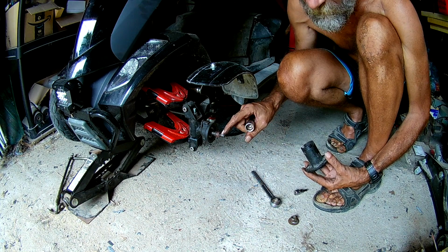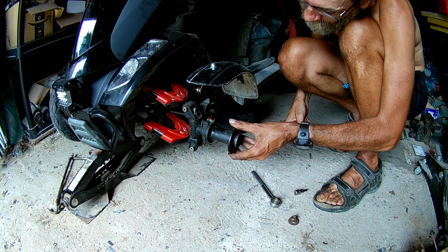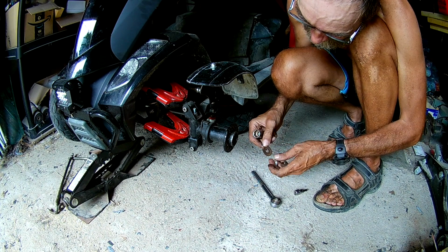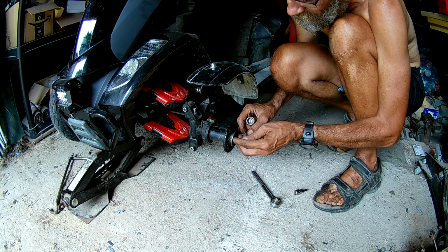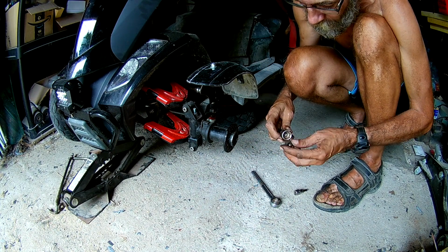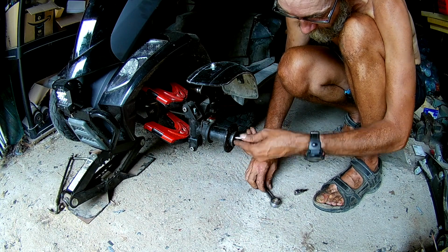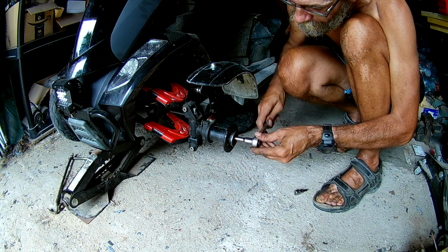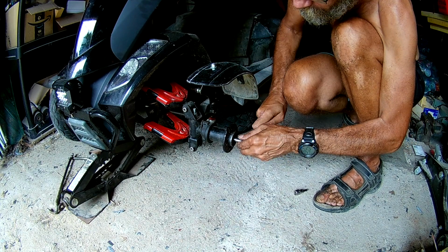First thing I noticed is the threads are stripped on the axle here. I may have to get a new hub, or a new bracket. That's not good. That might be why I might not be able to tighten it all the way. Eventually, that's going to be a problem. That's not good. I can get it tight.